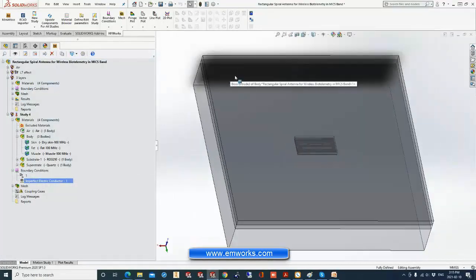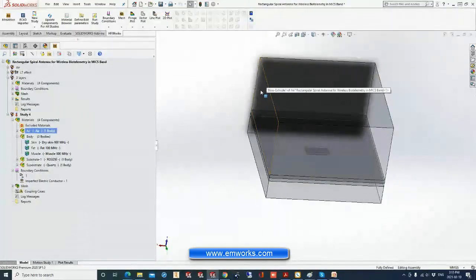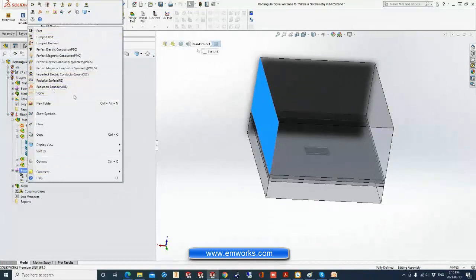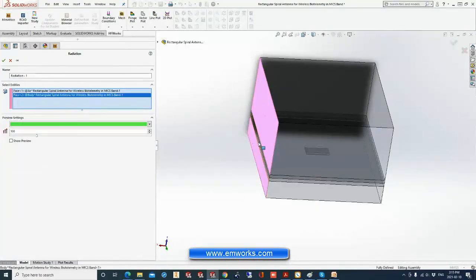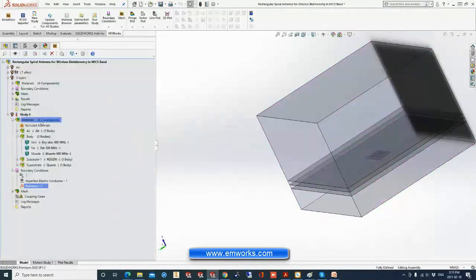The third point is to define the radiation boundary, or what is called the absorbing boundary. In real life there is no truncation of the air around the structure, so we have to apply some boundary to avoid the reflection of the wave at the end of our computation domain, because it's an infinite area, infinite air around. We just have to select radiation boundary and apply it on all external faces of our structure. Actually, I can copy and paste from the previous one. Okay, radiation boundary. So I'll copy everything.